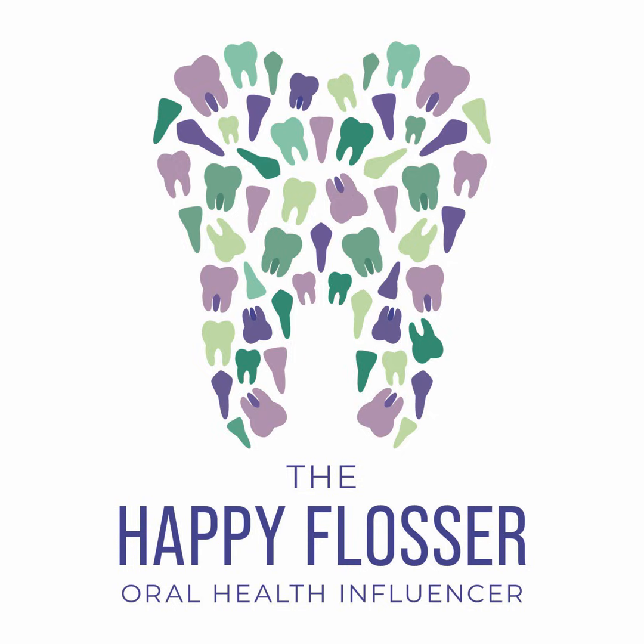Those are things that help you when you're looking at your patient's risk factors or symptoms, signs, and significance. If you think about comparing the findings, if somebody shows up with a new area of decay, that could be a concern. But if you look at the previous radiographs and they're a couple of years old and it hasn't changed at all, it might not be as significant as you first thought when you were doing your interpretation. So use the previous radiographs once you've completed your radiographic interpretation on your current x-rays.